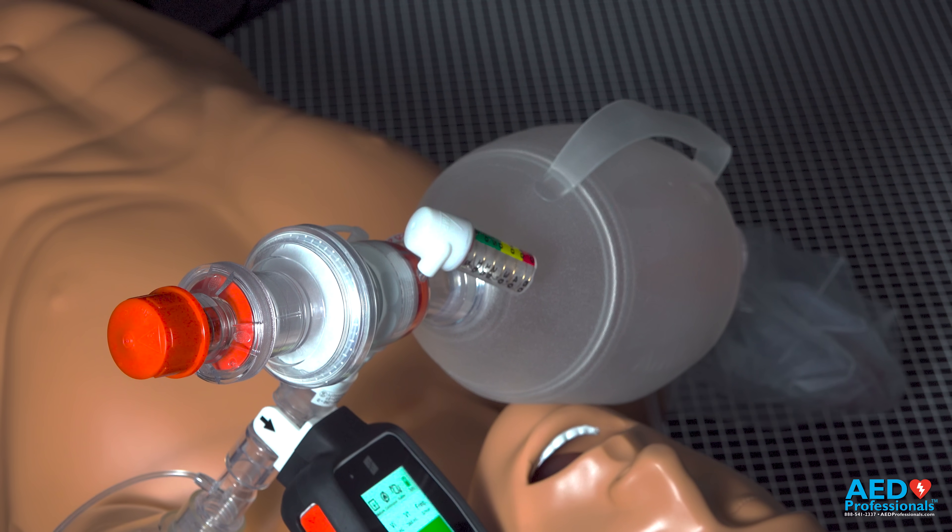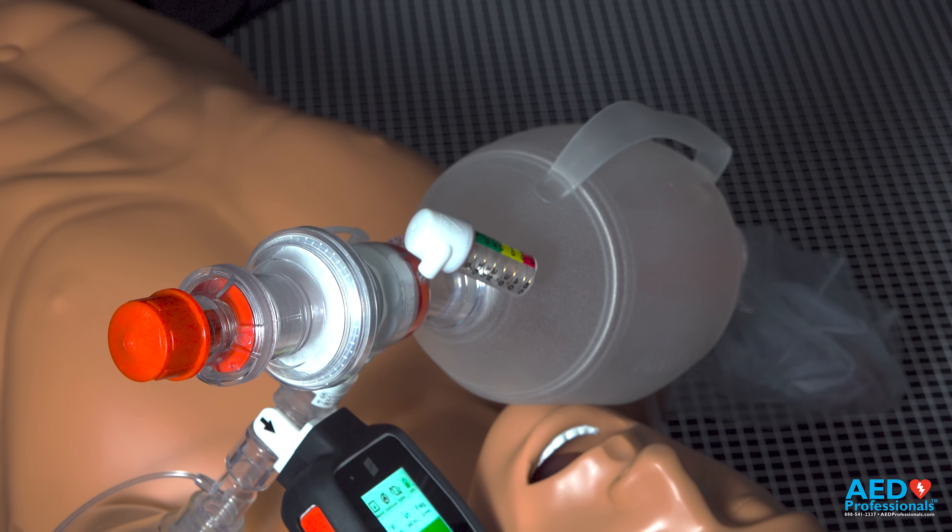Hey everybody, my name is Jordan. I'm with AED Professionals, and in this video we're going to go over how to use the clinical EO Life device with a BVM on a mannequin.